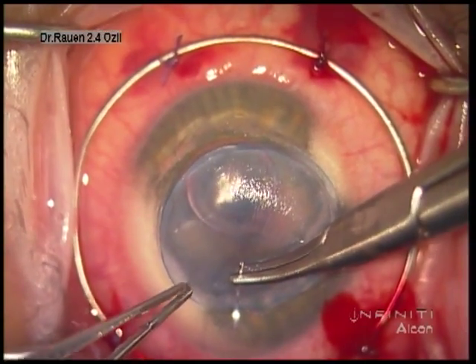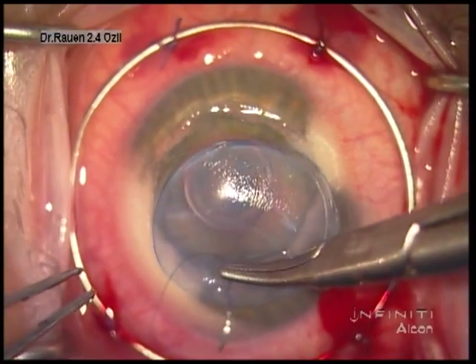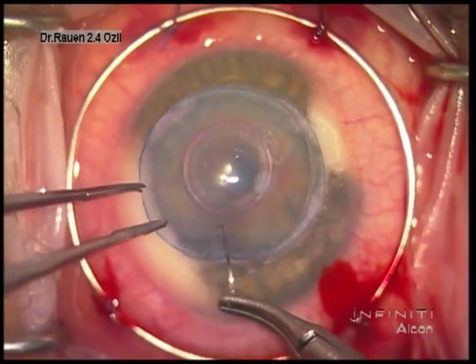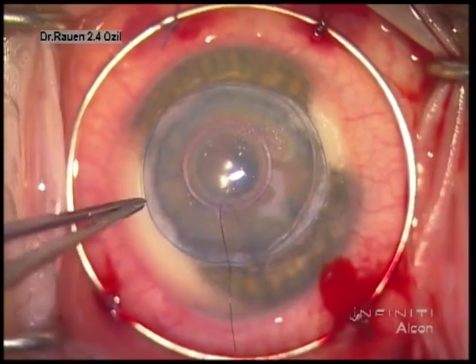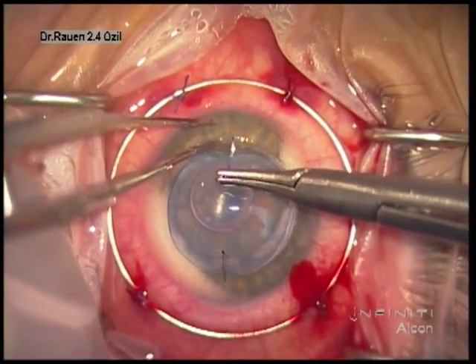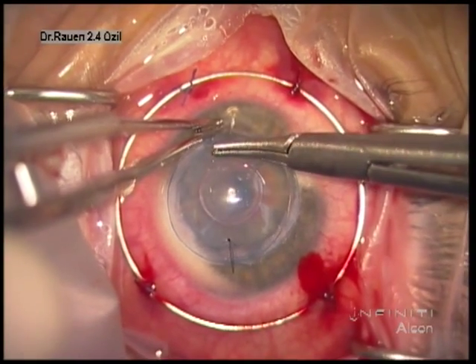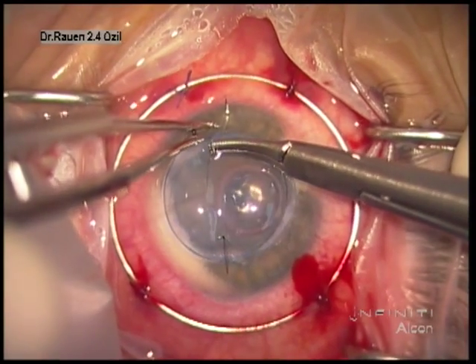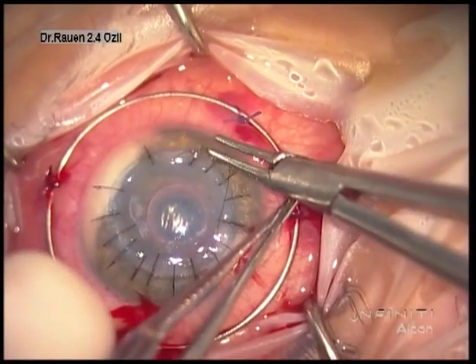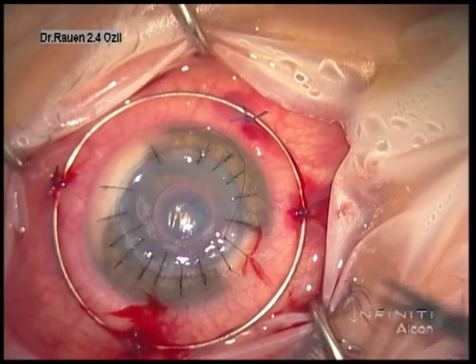Our typical suturing technique is with interrupted sutures. In this particular case, the opening generated by the initial trephination was 8 mm. This particular cornea was punched at 8.25 mm, and we do this so we generate some flattening of the cornea. This patient's keratometry values were in the upper 50s, and so by flattening the cornea we should be able to deliver better vision.